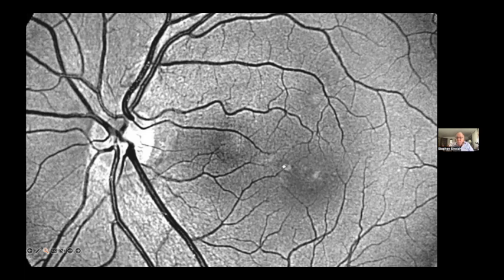But then you come back to me and say, well, Steve, so what is this causing in terms of the patient? And what we're now realizing is it's early neuronal injury, apoptosis and death, and focal defects in the visual field. And you don't see so much right in the fovea, which is really interesting because there are no microvascular changes, less so here, but these become progressive as you move away. So these are still within the central field and still causing defects when we analyze them early in the visual function process.